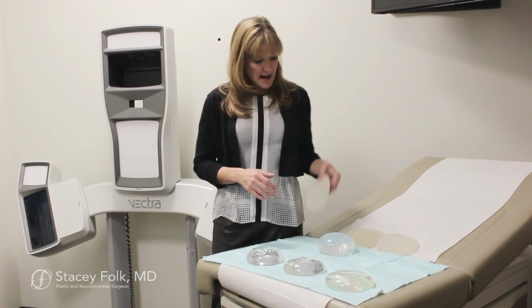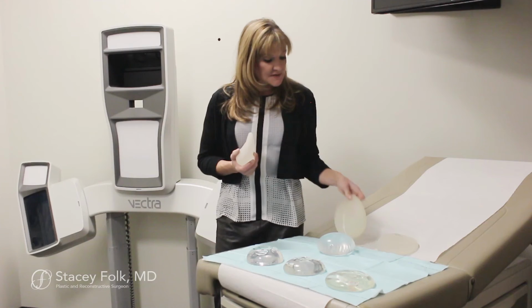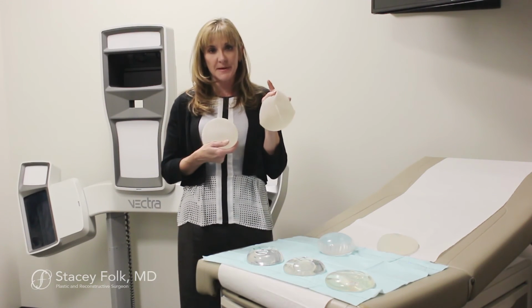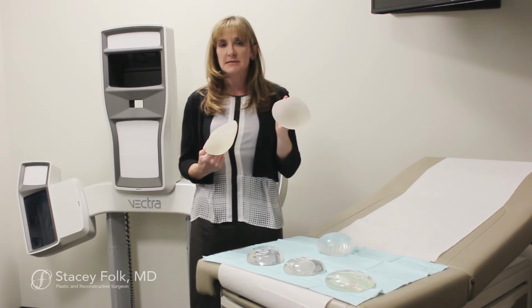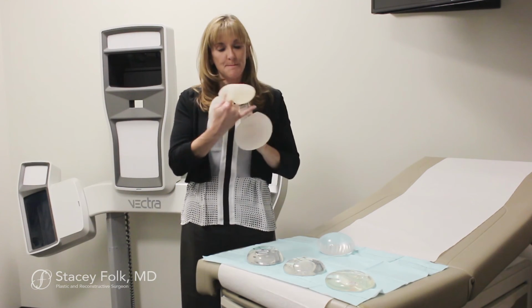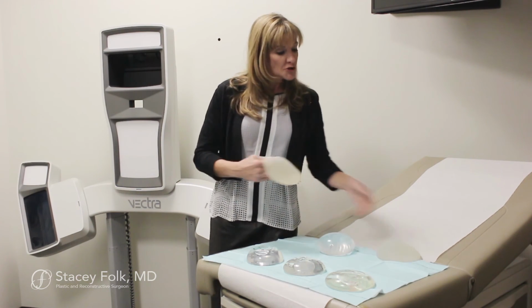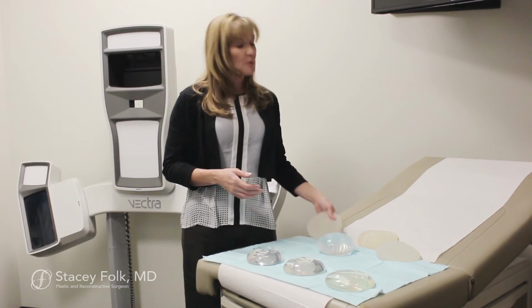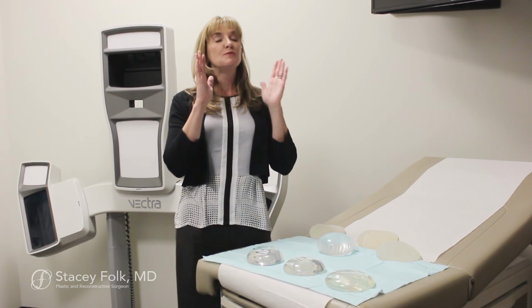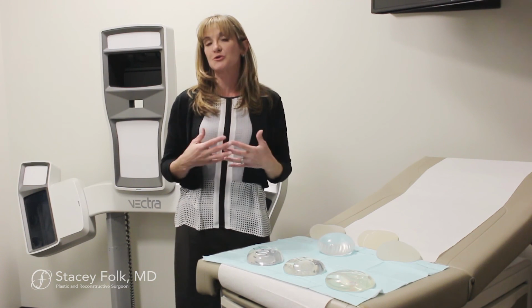We also have anatomic or teardrop-shaped implants, and these vary significantly from company to company, but we have a number of different sizes, projection, and base diameters and heights that people can choose from. So this becomes a very specific type of implant that we will go for, that is really geared specifically for what your body needs in order to achieve your goals.